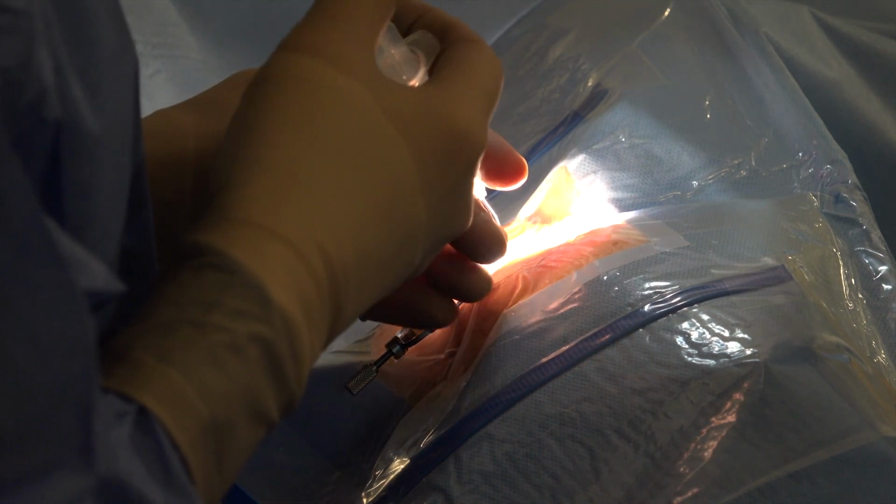So one of the first studies included 210 people, and 97% of them got basically within a line of 20/20, which is great. And there were very few complications. One of them was that the lens that gets put in the eye rotated a little bit. And for that, then you just have to go back to surgery and they will reposition it. And then another study, which looked at 83 people followed for 5 years, found that 95% of them had 20/25 vision or better. So again, pretty good.